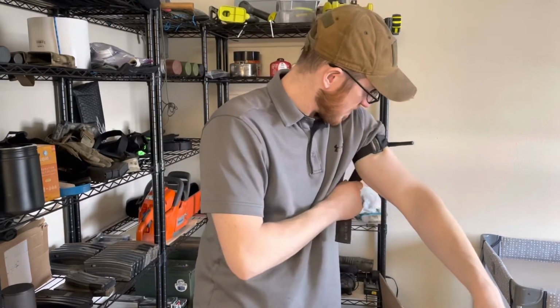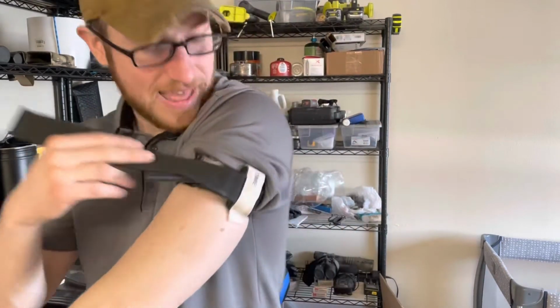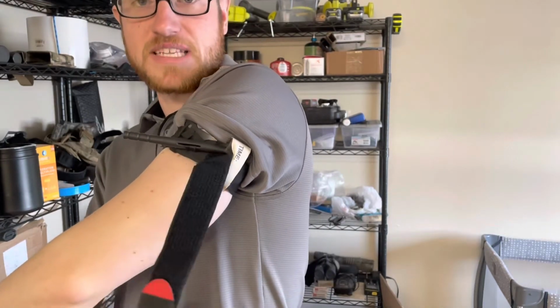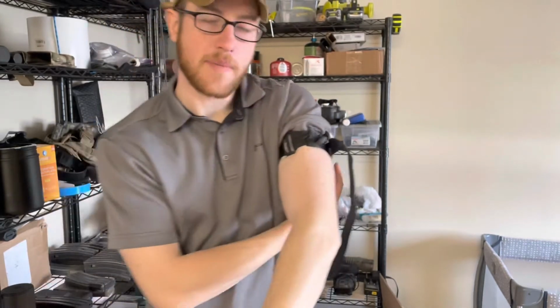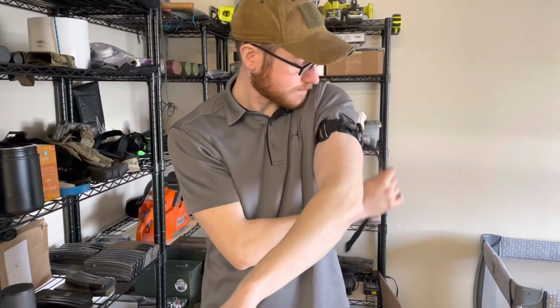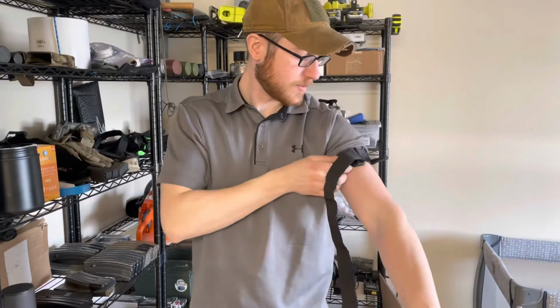Give me a second. And you can see it. Oh, I didn't. So see that? If I went to take it off, this is why you want to secure that band, because if this gets snug on something, like if you snag it on whatever, and then you pop this tourniquet, you're going to have a problem. Oh man, that feels incredible.